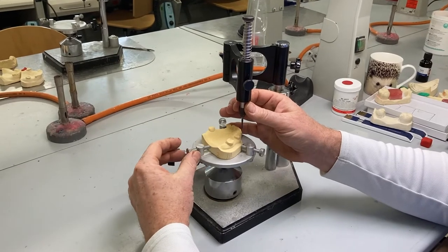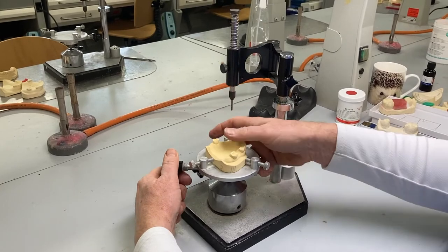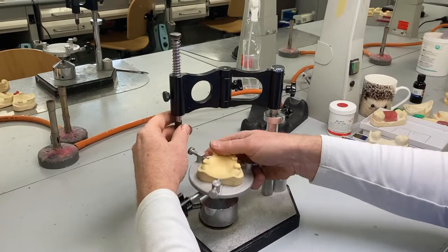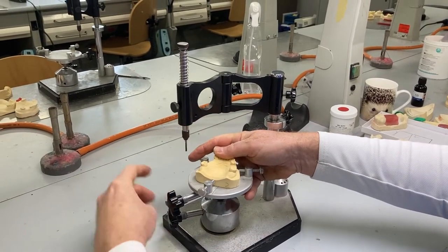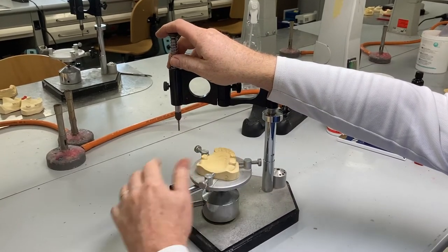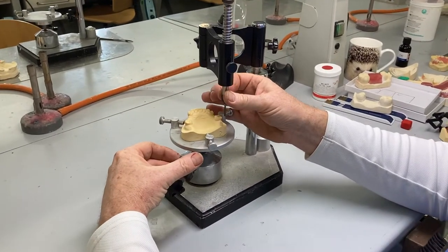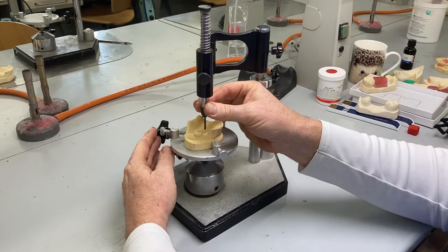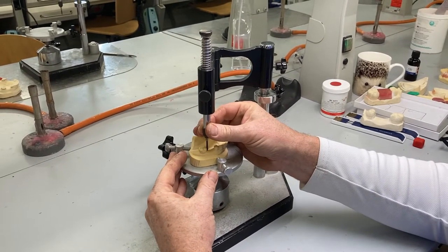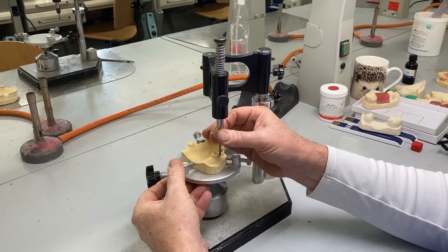In this case, it's the abutment teeth to the saddle areas. If the model angle isn't quite right, we loosen this by a quarter of a turn — you can see that the table will move to any angle we wish — and then we can lock it up at the correct plane. Here we're surveying this model relative to the path of displacement. I can take my surveyor arm down to gingival level and using the side of the pencil I can scribe around the abutment tooth, and you should see a nice bold line.